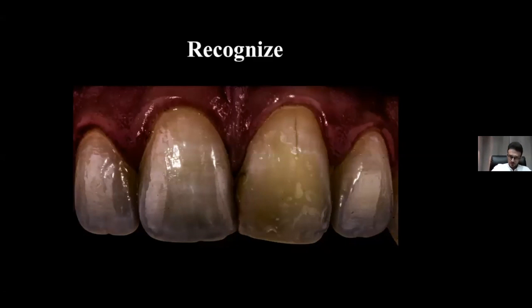But this trick has a drawback, which is that the teeth don't regain their value quickly, and this affects making the natural teeth's actual gloss and final luster. So this will hinder and delay the last step in the restoration production. But anyway, it's a tip that can help if you don't have a camera beside you while doing this step.